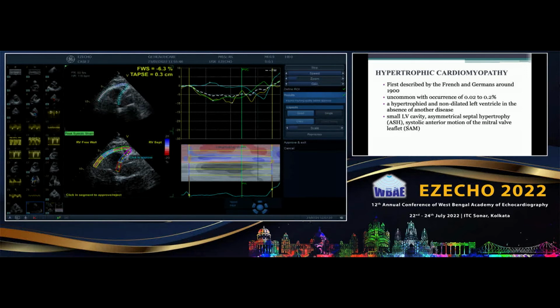I think if the LV dysfunction is present in isolated MS in the absence of AF, they generally recover. But if it is cardiomyopathy, if there is some rhythm problem, then it becomes very difficult. And I think the age also matters. Once the RV goes, it is very difficult to come back. LV is not a problem. Even mild LV dysfunction can improve after the mitral valve surgery. But RV doesn't come back, and RV is a very important problem in this particular population.